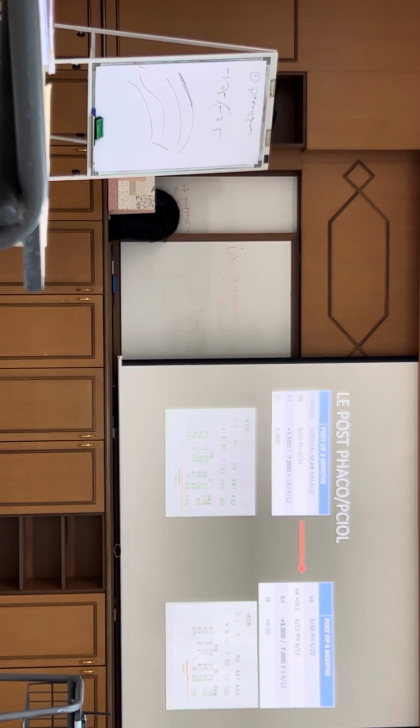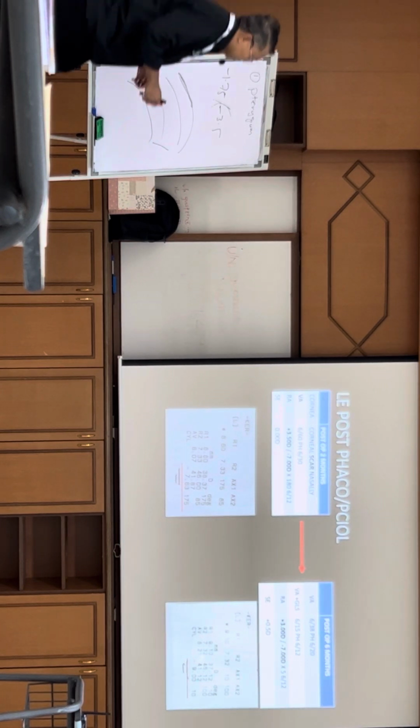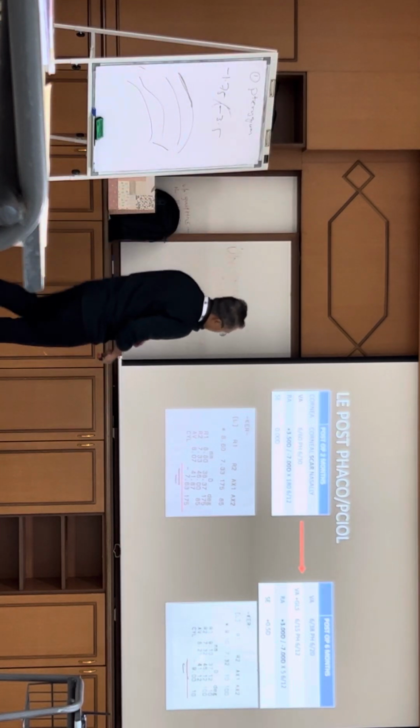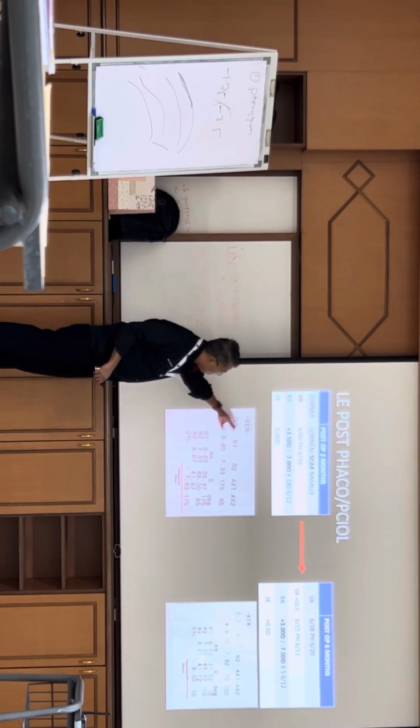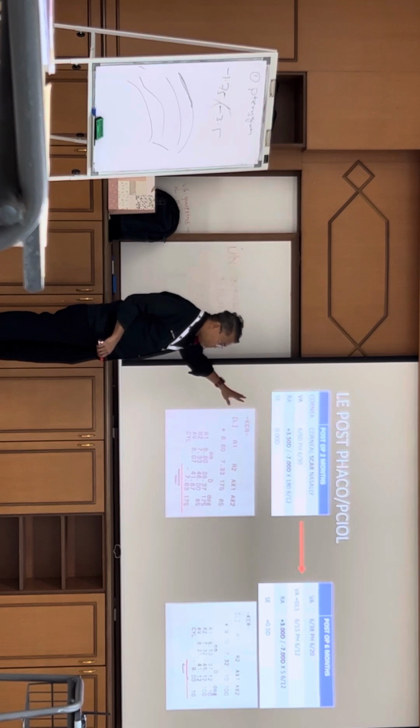So that's what Prof is addressing, the astigmatism, right? So how about the spherical correction? You mean this is after implanting the lens? Yeah, after implanted the lens. So how to avoid the spherical hyperopic shift? The reason is actually what I said to you just now. You are correct. Not only that, the incision that we do actually induces this hyperopic shift as well.